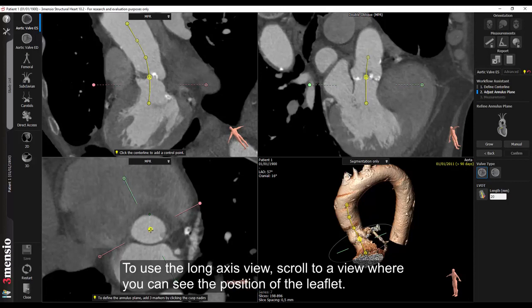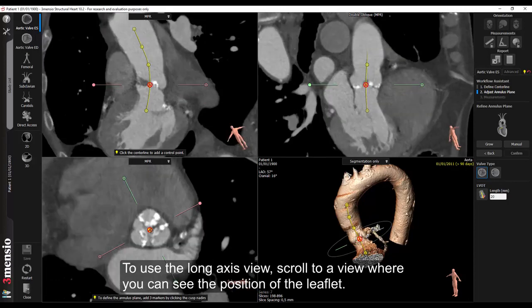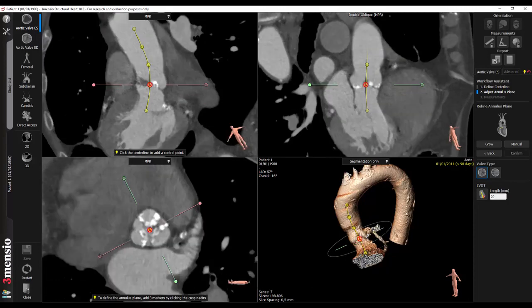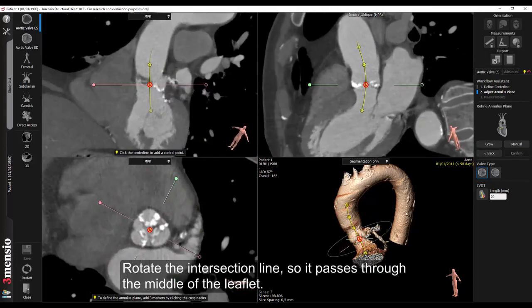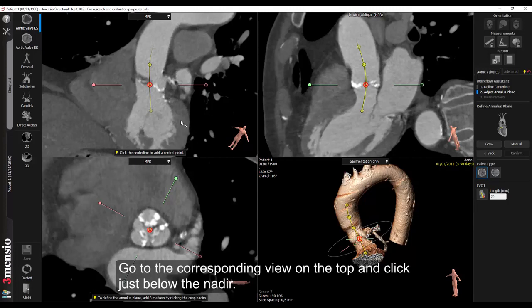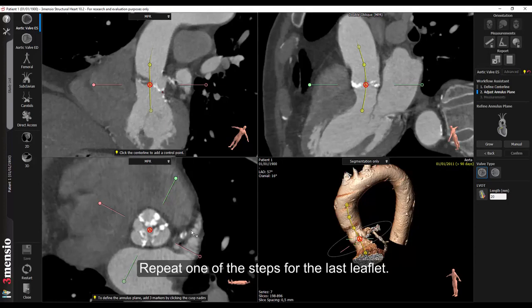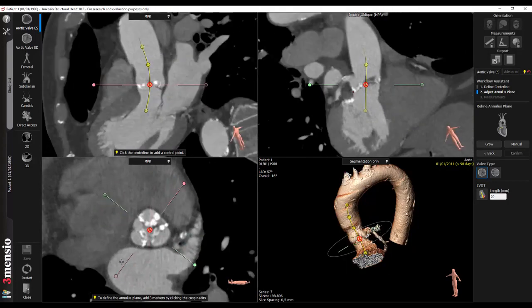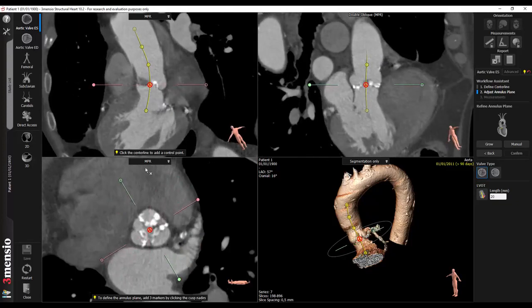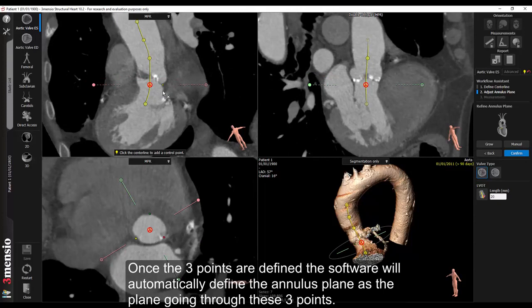Click the point where the leaflet has just disappeared out of view. To use the long axis view, scroll to a view where you can see the position of the leaflet. Rotate the intersection line so it passes through the middle of the leaflet. Go to the corresponding view on the top and click just below the nadir. Repeat one of the steps for the last leaflet.